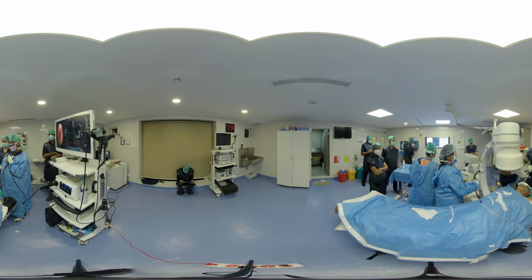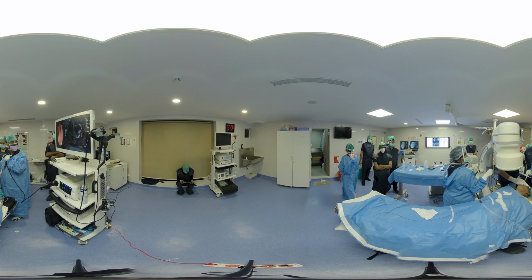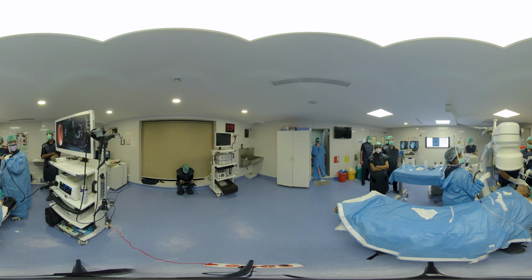Keep another cup ready, a smaller one. Cryo.